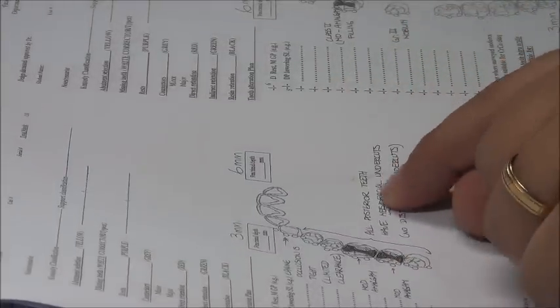Mechanical, if I have tissue undercuts. In this case, I look for some tissue undercuts here that can aid in my retention. Okay? So we finished retention. Next is support. Can I put a rest on the lateral? Where am I going to get my support? Once more from the tissue. The coverage of the tissue in the free saddle area and the coverage of the palate will provide me with the support I need, so no need for a rest.